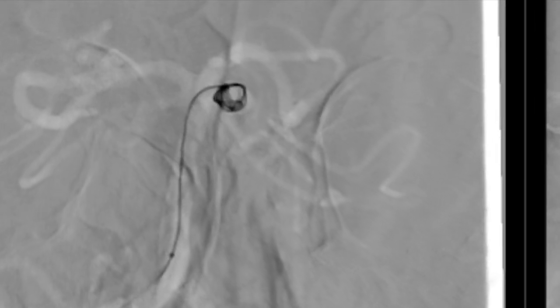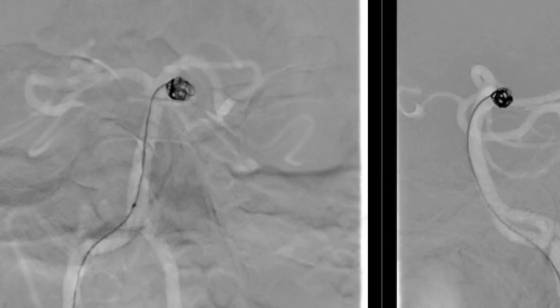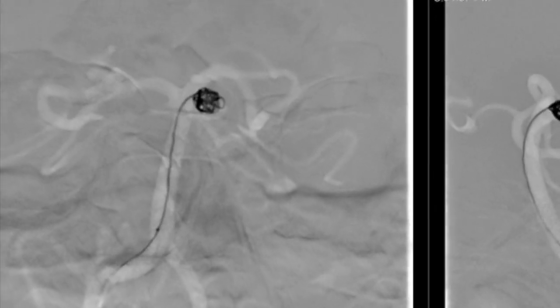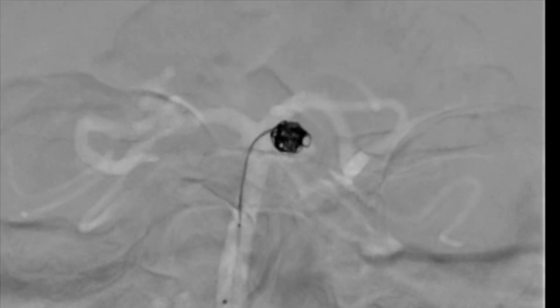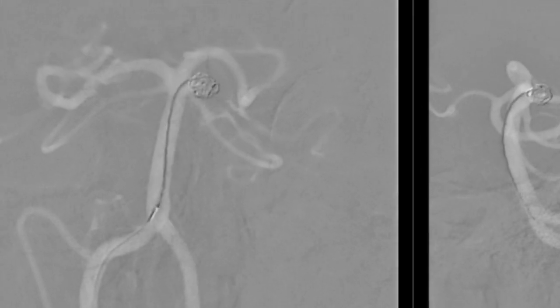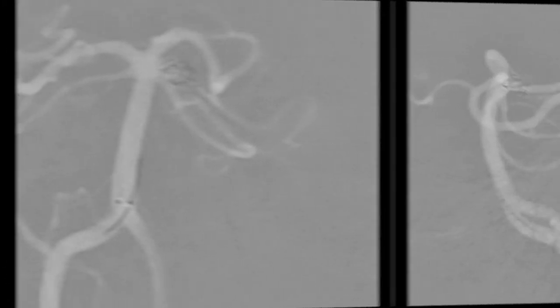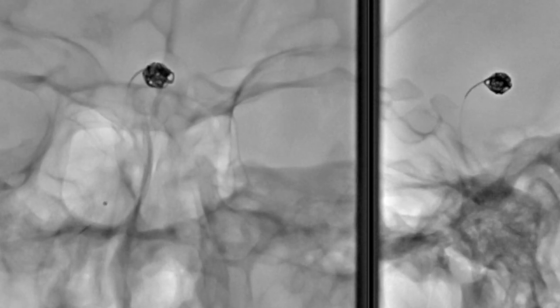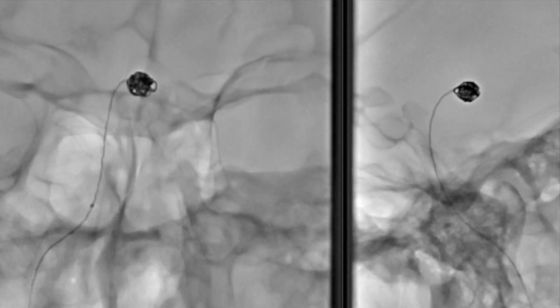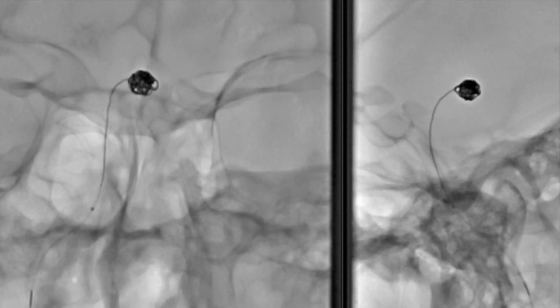And now we're putting a coil into the aneurysm. I sped this up, particularly because it does take us a little time, and we like to be delicate. But we did want to show the coils going into the aneurysm, and so you put one in, and then you put another in, and as long as you can still keep putting in a coil and it feels safe and it feels good, you keep putting more coils in until you feel like you've sufficiently packed the aneurysm with the coils. And coils are made of platinum.